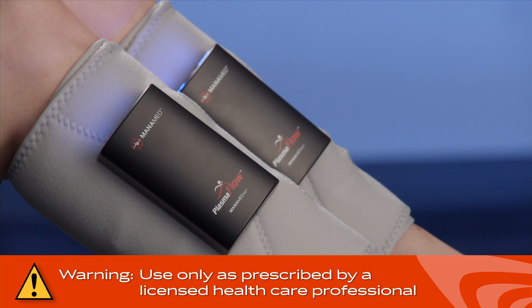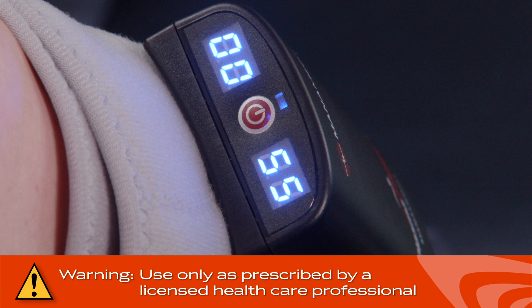Be sure to use PlasmaFlow as prescribed by a licensed healthcare professional. Do not use PlasmaFlow if you have not received or do not understand your doctor's instructions.